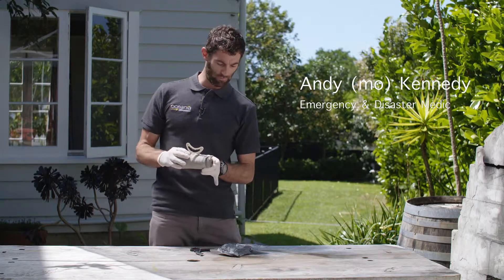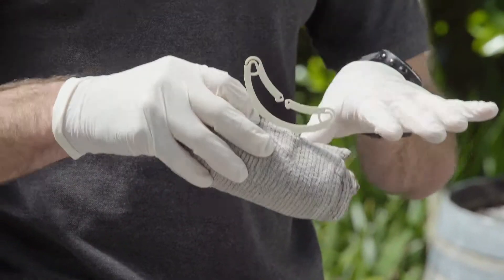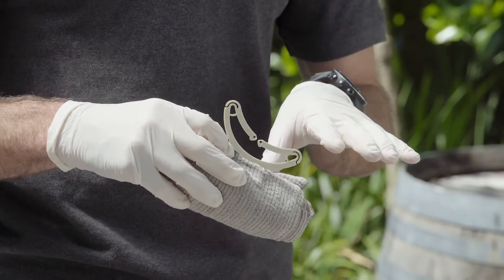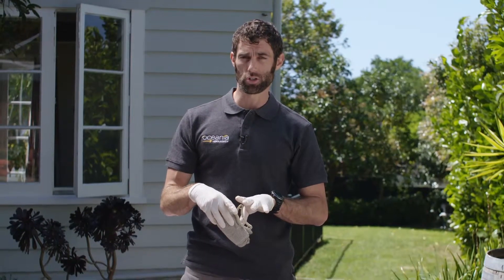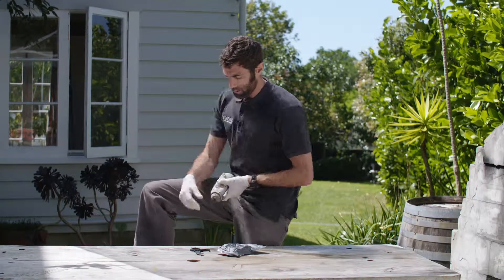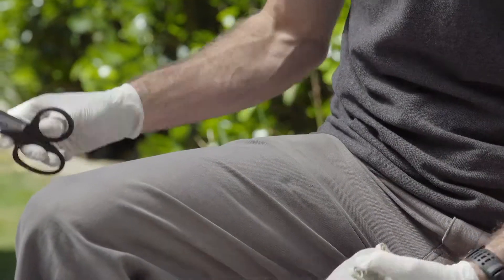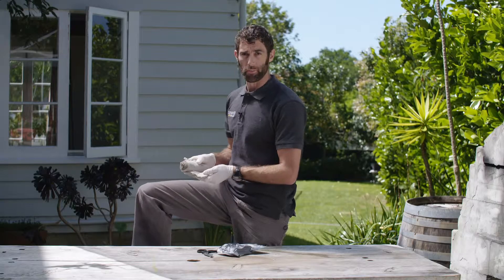The emergency bandage is often referred to as the Israeli or the trauma bandage, designed for putting direct pressure onto the wound after you've put in any sealox gauze or combine dressing. When you put it on, it's important to remember to remove all the clothes — cut around the clothes, get it right off, and then apply the bandage.